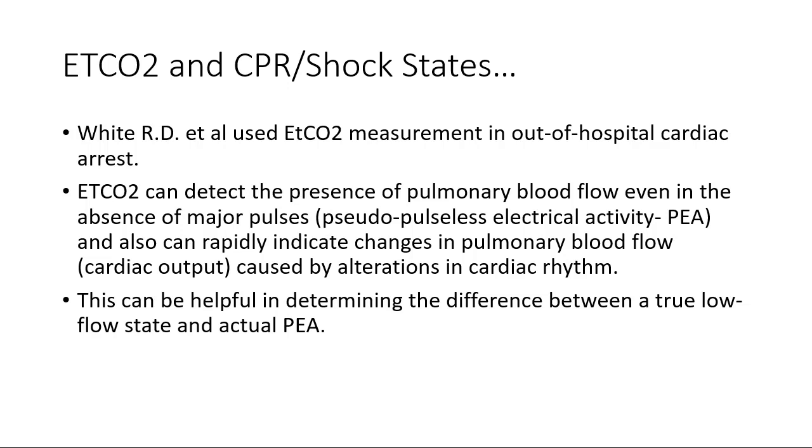Say you just resuscitated a patient, and you're about to consider going down the hallway, you're packaging up, and suddenly your end-tidal CO2 goes from 40 to 20. Still a good waveform. I want to stress this. Still a good waveform. The waveform is the proper shape, has a plateau, everything, but the number drops. That's a sign that within the next 2 minutes, the patient's about to code.